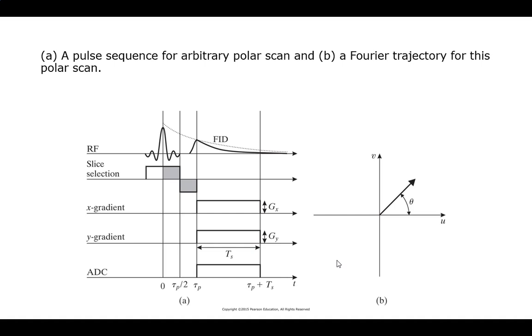Okay, so just so I can think about this correctly, the TS length, is that going to determine your sample frequency in your K-space? It'll determine how far out you go. Since that gives you a distance, in essence, in that frequency area, it does, because remember, the further you are in the frequency, the bigger that region you go, that's determined by your sampling time.